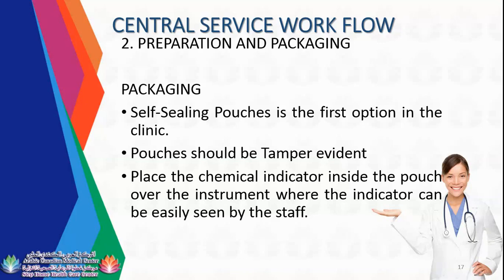Place the chemical indicator inside the pouch, over the instrument, where the indicator can be easily seen by the staff. Guys, please be aware of the term "over the instrument", because in the exam it means something different to them. The proper term is "next to the instrument". I used "over" on this slide because you put the chemical indicator above the instruments, on the outer layer or plastic area of the pouch. But they use "next to the instrument", so the chemical indicator should be placed next to the instrument, not over the instrument.